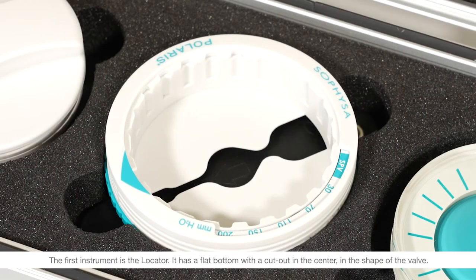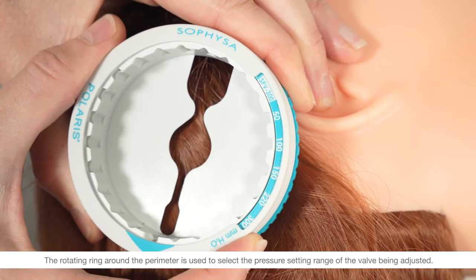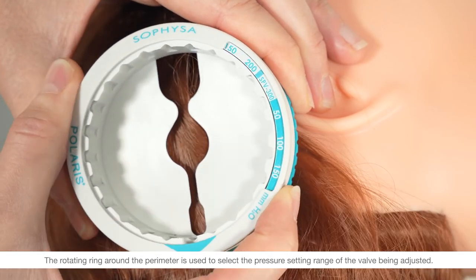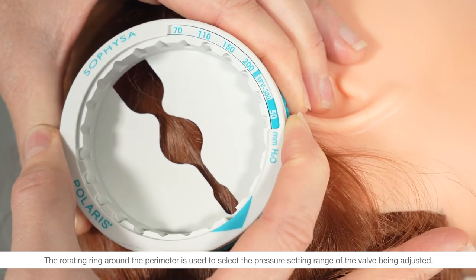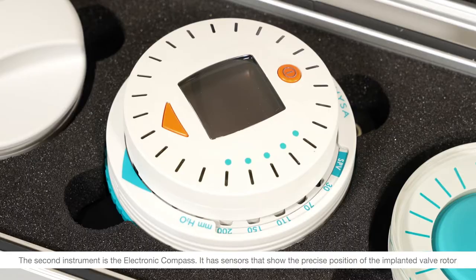The first instrument is the locator. It has a flat bottom with a cutout in the center in the shape of the valve. The rotating ring around the perimeter is used to select the pressure setting range of the valve being adjusted.